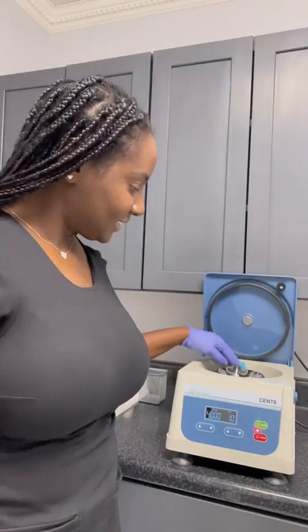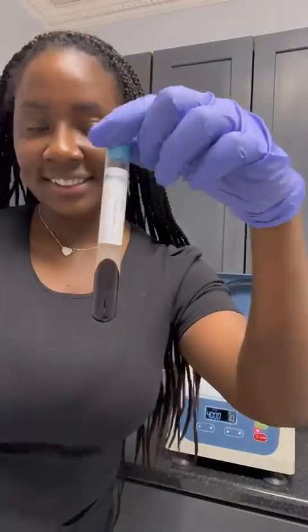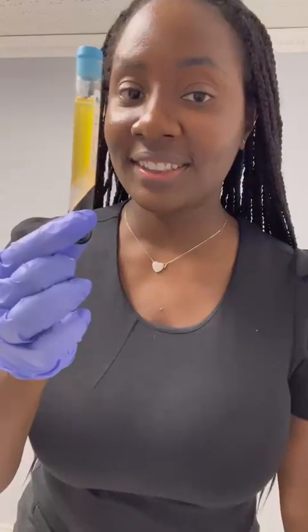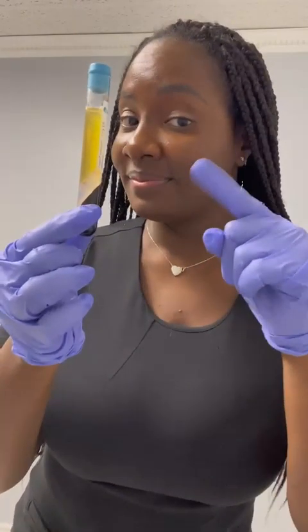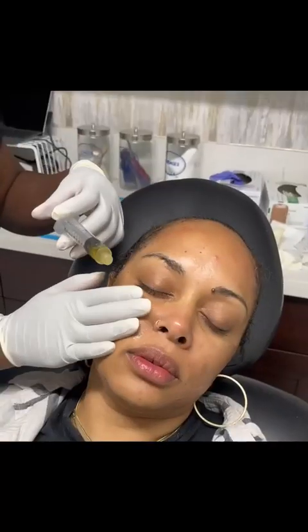This machine is very easy to use. While you're prepping your client for the procedure, when you come back, you're done. This is liquid gold. Their Juventix tubes with their liquid ingredients help separate the red blood cells from the plasma to give the maximum amount of plasma volume in the PRP tubes.